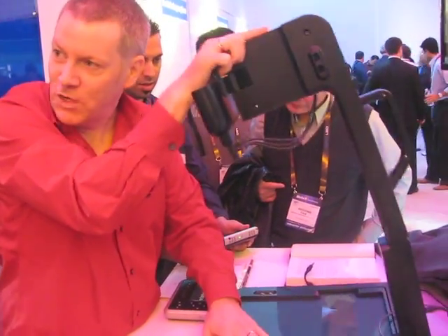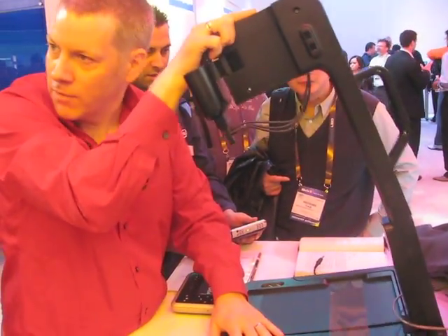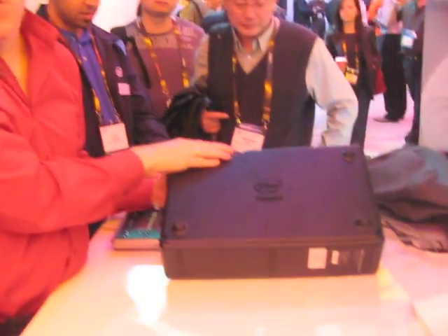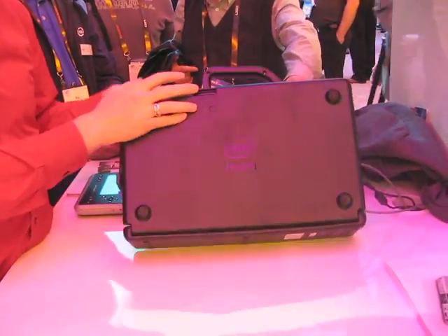That can bear a 50-pound load. Very sturdy, very strong. Now it also is very portable, so I can fold it up and take it on the go — got a handle, got a thing to go.